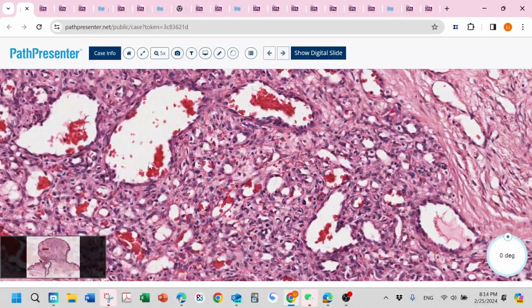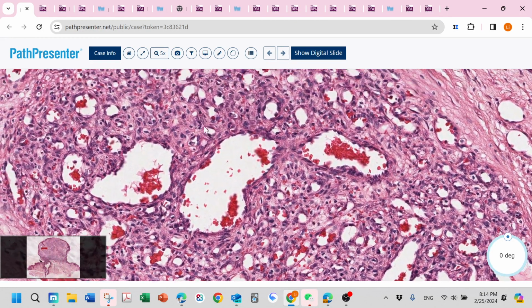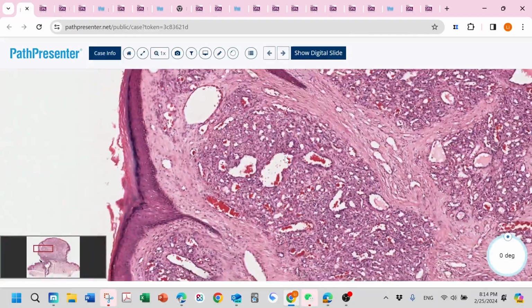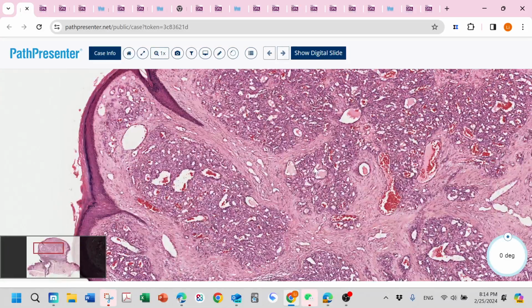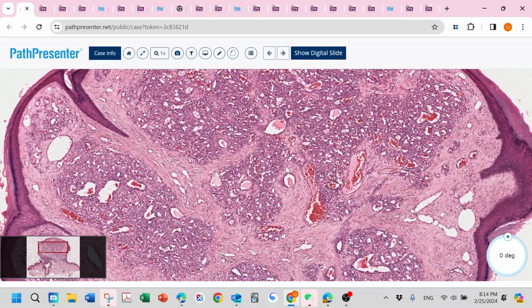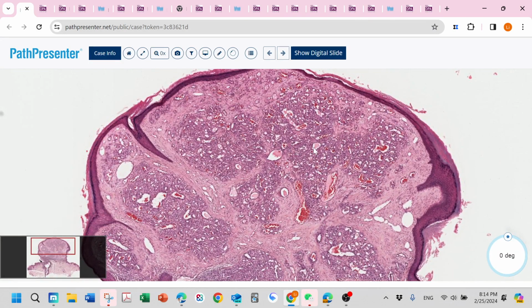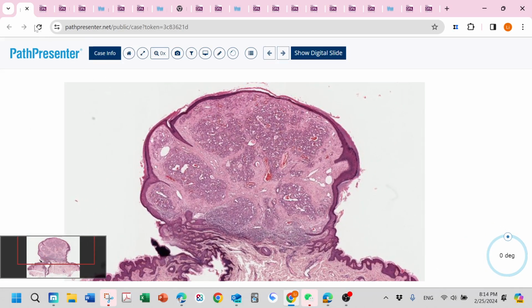Let's look at the cytology feature. They are really bland. Sometimes if irritated or traumatized, you may see tons of inflammatory cells, but that is normal. We also think this is not a true tumor, more like a reactive lesion, just like you get traumatized and then this lesion gets more blood supply, so they get this reactive proliferation of small vessels. So this one is pyogenic granuloma.